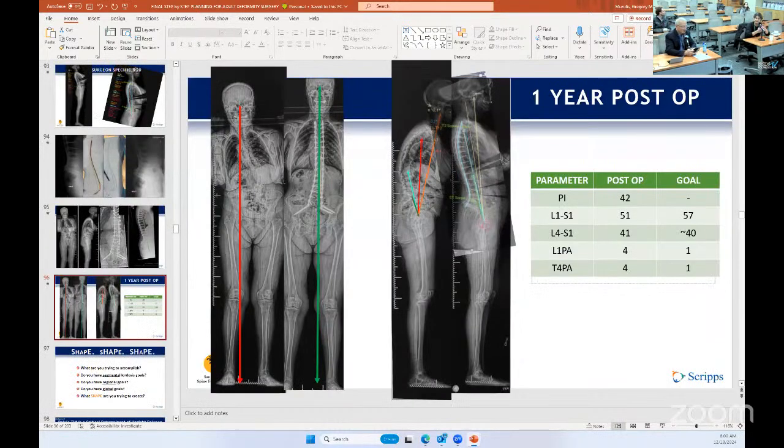So I think you predicted one question by Dr. Yoshi with all this parameter planning being more sophisticated and insightful, pre-contoured rods. You kind of preempted that question already. Is this a routine application for you nowadays, pre-contoured rods, or do you still craft them as you see fit?